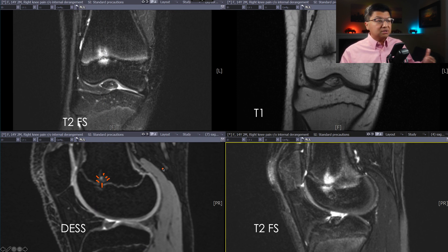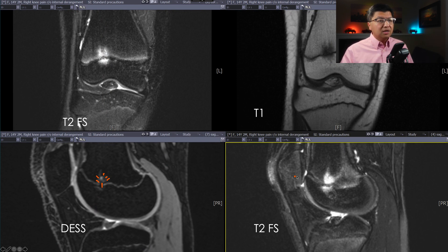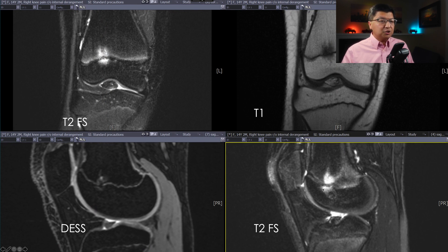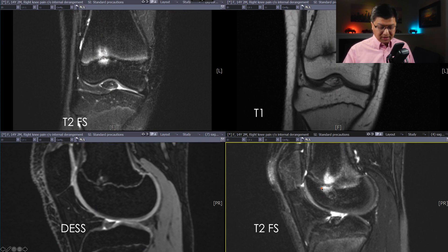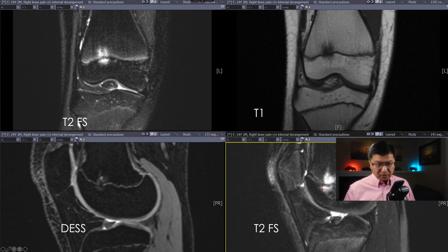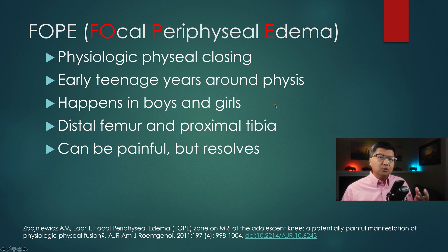And once the physis fuses, the pain will go away completely — so it's sort of a growing pain, if you will. Looking at the fat-suppressed fluid-sensitive sequence in the lower right-hand side, it just shows you another example of the physis beginning to close in this area with some periphyseal edema. This condition is known as FOPE — focal periphyseal edema — and fundamentally, it is physiologic closing of the physis.